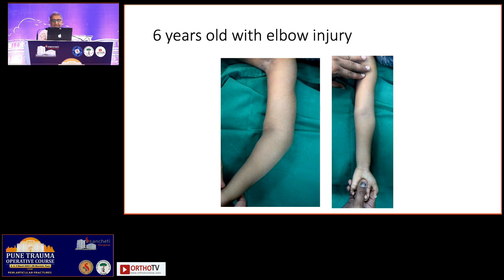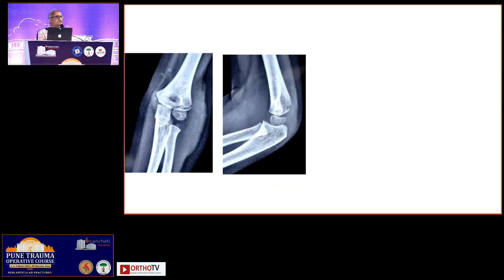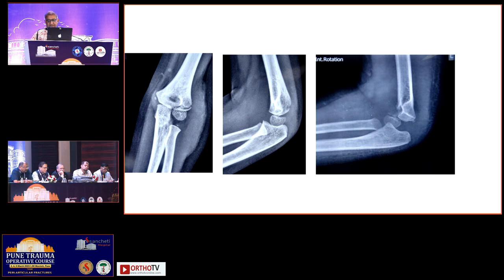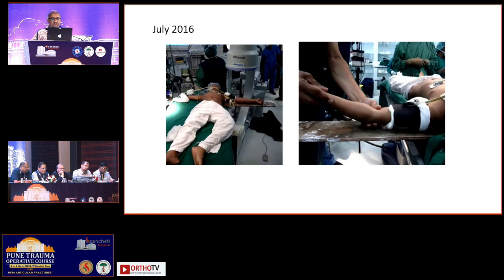So this is a 6-year-old child with an elbow injury. This is the X-ray. It is important to take an internal rotation view. And there is something important here. When you take this X-ray, you see this translation. It tells you that this is an unstable fracture and needs to be fixed. So it's not fixing in a cast, it's reduction and pinning.